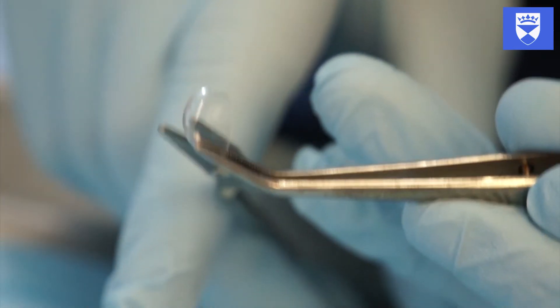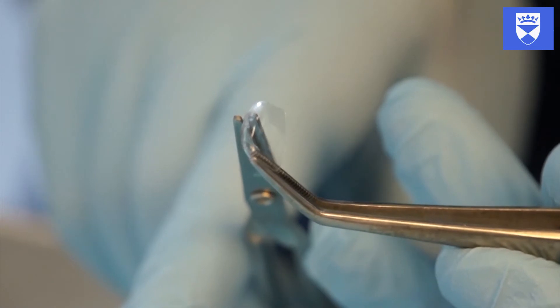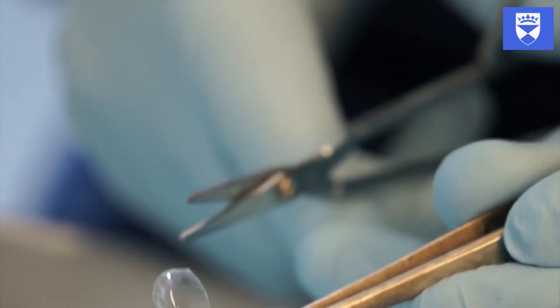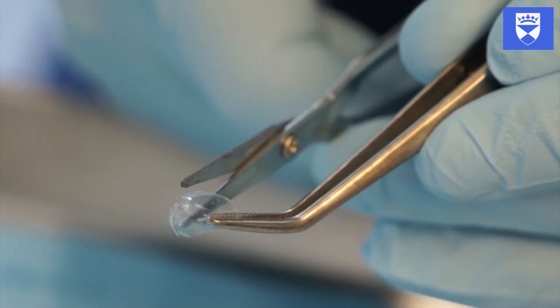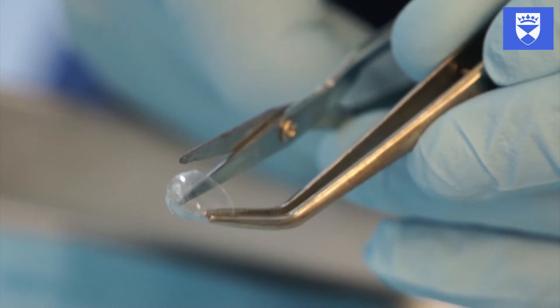When you have selected the correct crown, cut it to the appropriate size to facilitate clinical use. The crown should be trimmed to encompass the defect and surrounding hard tissue to be bonded. A sharp pair of scissors is ideal for this.